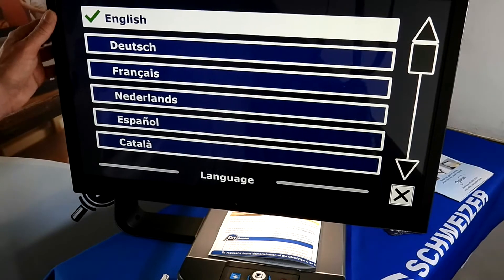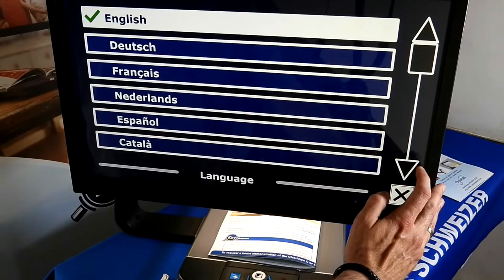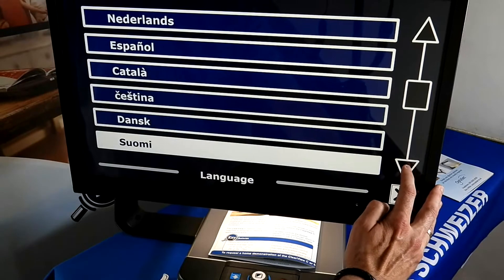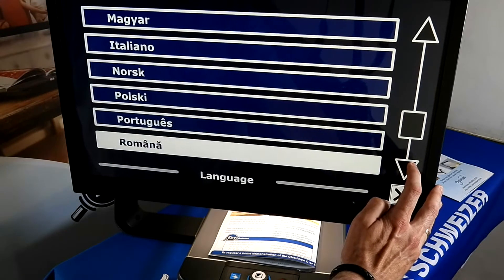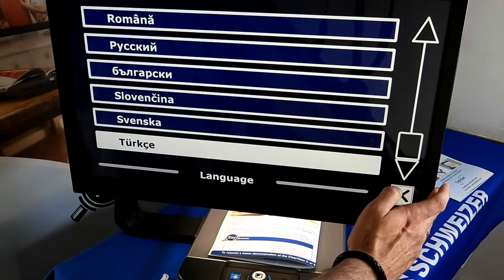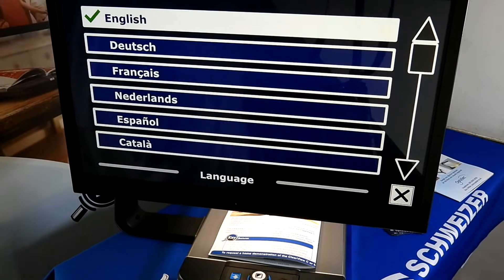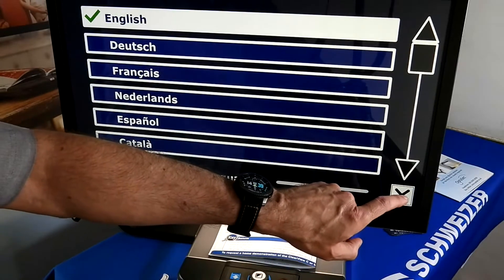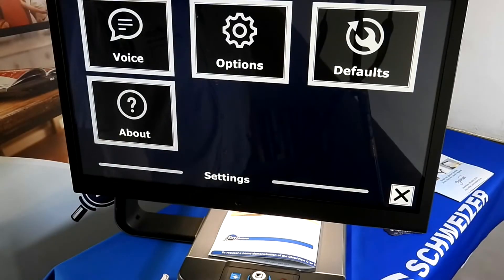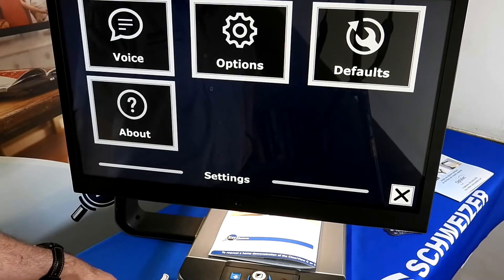As you can see, we also have a vast range of languages available. If you speak more than one language, you can certainly select more than one language and it will read the document in that particular language. It won't translate, but if you put a German, French, Spanish, or Italian textbook underneath and select the appropriate language, then it will read it in that language.